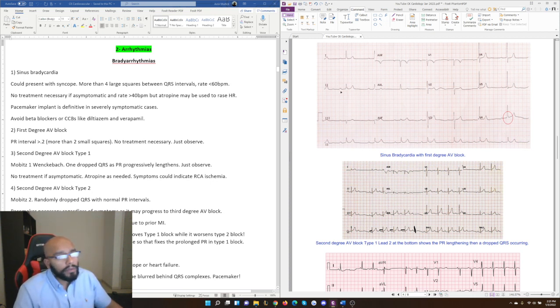It's not always going to be super obvious and you can't always see it, but what you clearly see here is there is bradycardia. Okay, so first degree AV block is really only apparent because of this portion here. You usually won't even really catch that, and it's usually not really visible, and that's okay because it doesn't really require treatment, so you don't need to identify it.